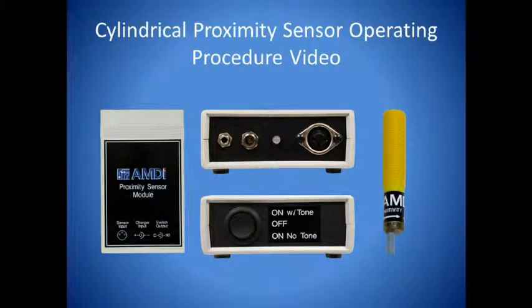Welcome to the Cylindrical Proximity Sensor operating instructional video. The cylindrical proximity sensor is good for end users that need to use a switch that can be activated with little or no touch. If the end user fatigues easily with a mechanical switch, then the proximity sensors are a good solution.